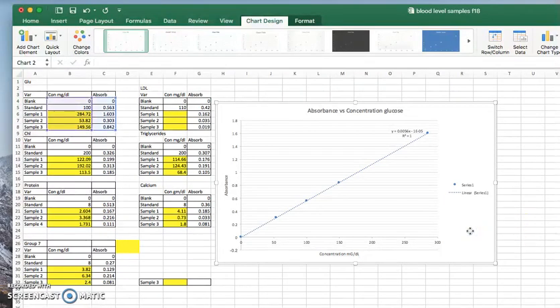So, as part of your conclusion, you have to say which values are in the normal range and which values are not in the normal range. Well, the only value that's actually in our normal range is this one, because the normal range for fasting is about 74 to 104. I've seen different values for that, so don't quote me on that exact range. For non-fasting, it's about 80 to 120. Again, I've seen different values. So this guy right here is way, way outside the range. So he is an abnormal sample. So I would say he is abnormal. This one is abnormal, and this one is abnormal. So all three of these samples are abnormal samples.